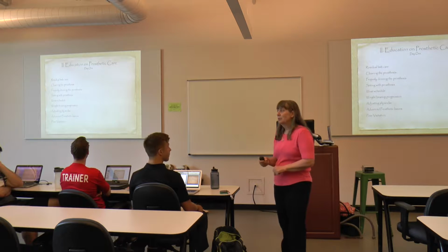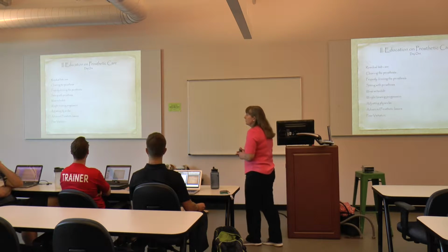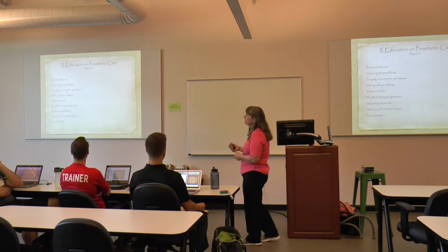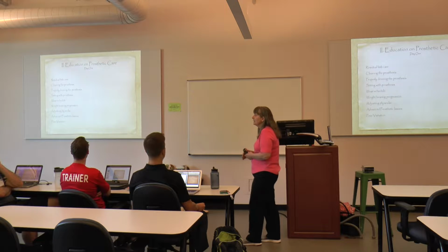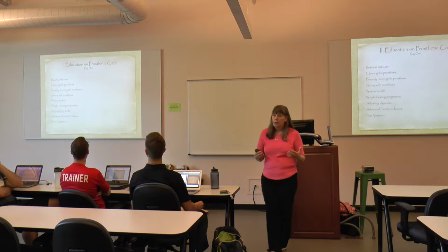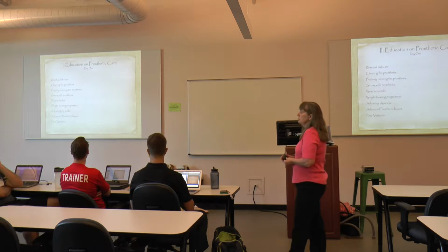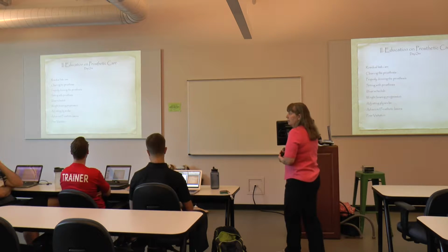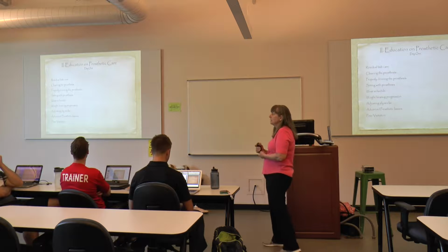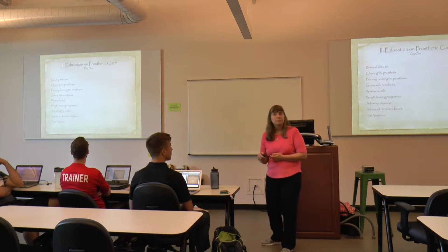And they ended up with something going wrong. So you need to start day one. One is residual limb care, cleaning the prosthesis. We're going over all these things, how to put it on, how to sit with it. That's like posture and sitting posture type of stuff. What the wear schedule should be, how to press the weight bearing on it, how to adjust the socks, and some advanced issues, and even possibly setting up a peer visit.